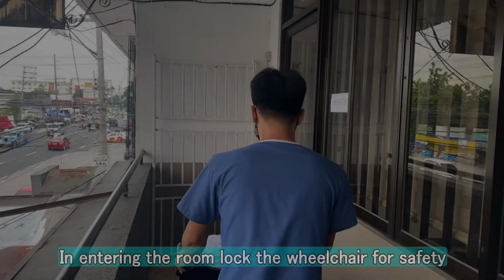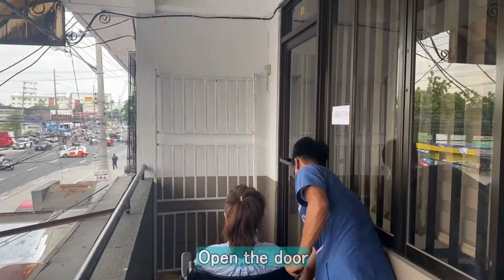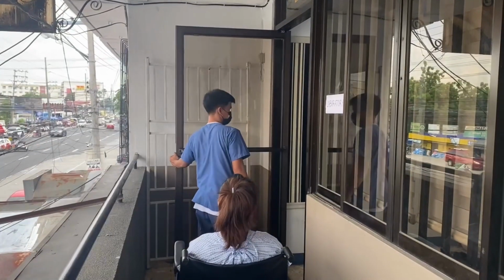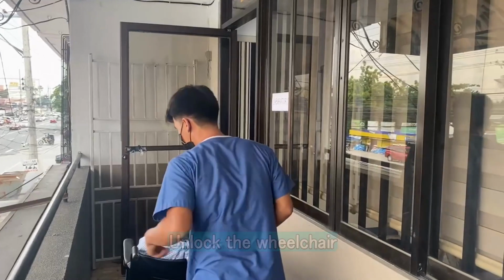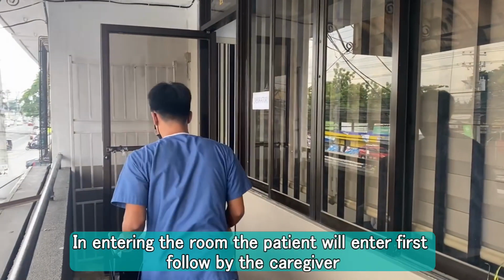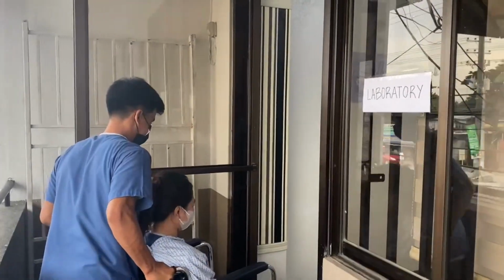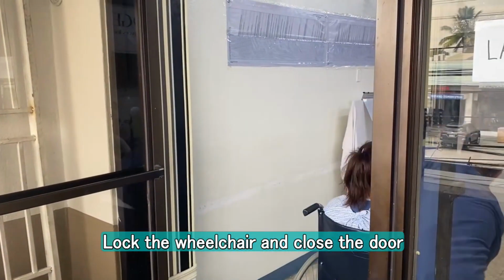In entering the room, lock the wheelchair for safety. Open the door. Unlock the wheelchair. In entering the room, the patient will enter first, followed by the caregiver. Lock the wheelchair and close the door.